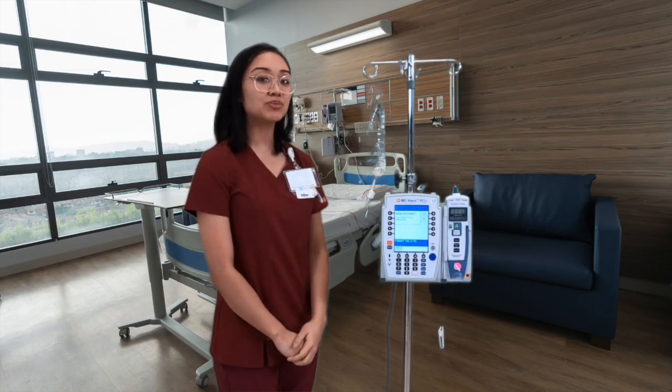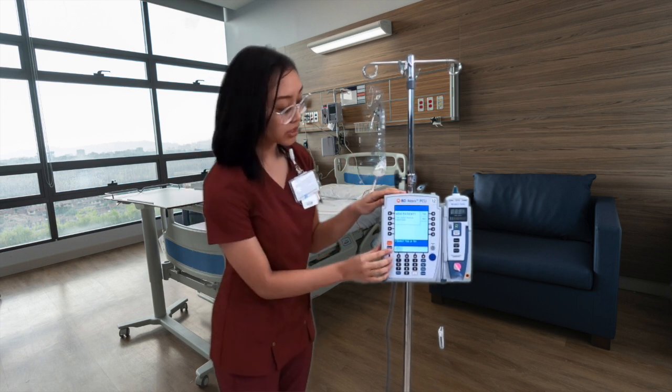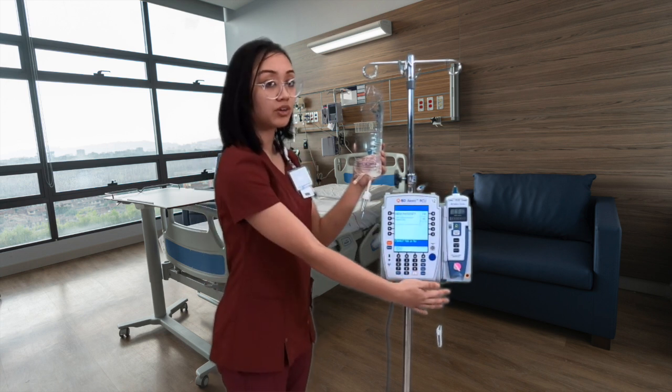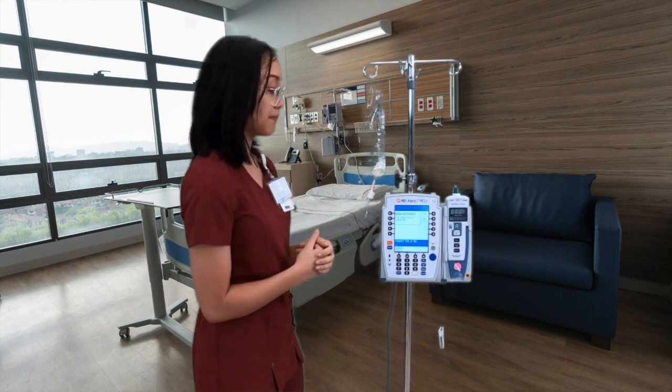Hi guys, my name is Mari and I'm going to be teaching you how to do an IV fluid bolus on the Alaris pump. I've already primed my tubing, connected to the patient, and we have our line set up, so now all we have to do is go ahead and program the pump.